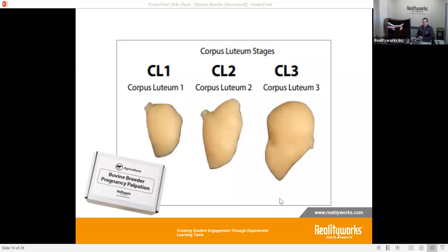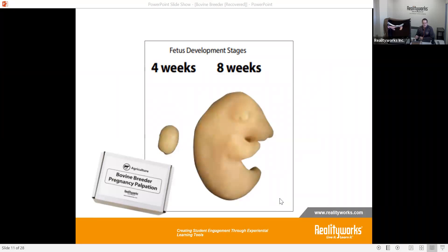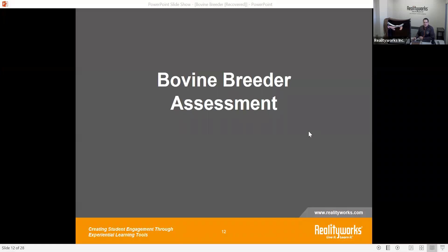We also have fetal development stages for four weeks and eight weeks. You can place these inside the uterus down into the pouches in the uterine horns so students can actually palpate and feel those areas.